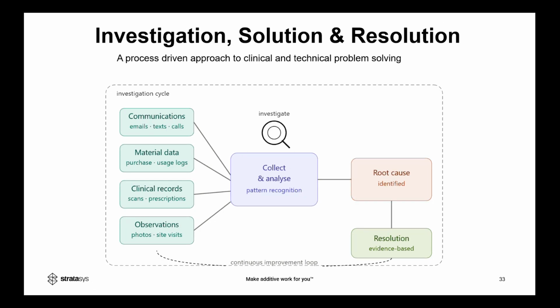Yes, I just created this little flow chart to show you what we do in an investigation, to find a solution and come up with a resolution to any problem you might have, whether it be with the machine or files, whatever it may be. As Adam and Adrian have said, we need to communicate. We need to collect all this data, clinical data, technical data, scan files and design files, and analyze that.